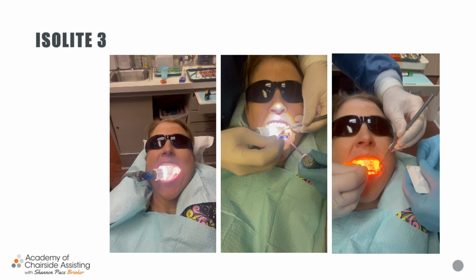Because if I am, as the assistant, just relying on my doctor's loops and they move around, which he does, I wouldn't be able to see. And we know as assistants, I can't have a light on mine and him have one on his, because we would do a light show. So this is, I think, a huge perk. And again, having the three, because if it was just one, it would be tough to utilize it. So I think that is really, really great, and making a decision on what works best for you. And if you're working alone and you don't have a light source on your loop, again, a good plus.